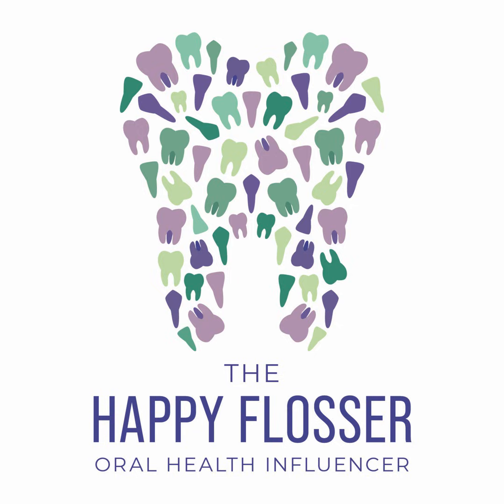You can make it as systematized as you want. I tend to look at all of the crowns of all of the teeth. I evaluate all of the enamel and the dentin and the restorations. Then I go back around and focus on the pulp and the pulp chambers and make sure everything looks okay there. Then I might examine the roots, looking for variations or dilacerations, or any anatomical anomalies that might be present. And then the periodontal ligament space specifically, I'm looking to make sure there's continuity there. I'm checking the lamina dura, making sure there's nothing that's a standout.